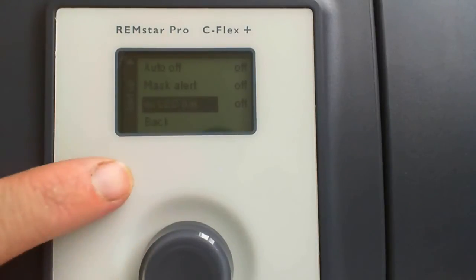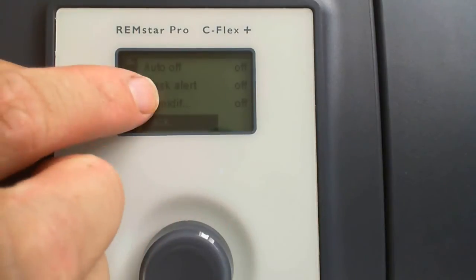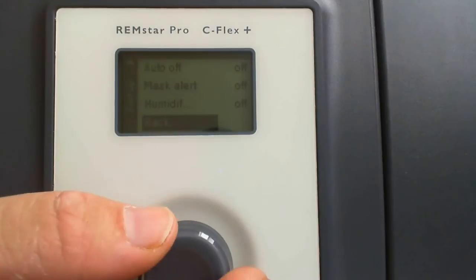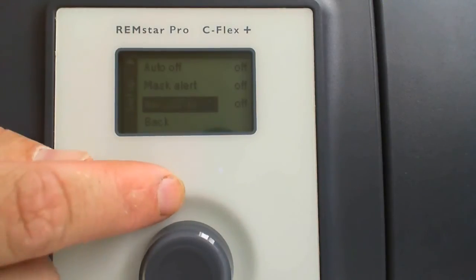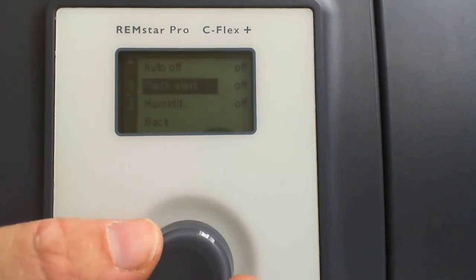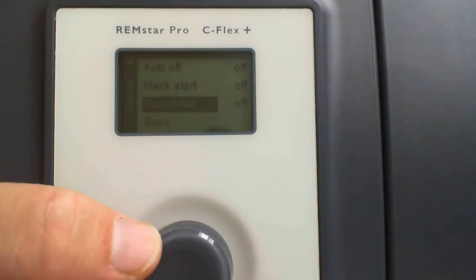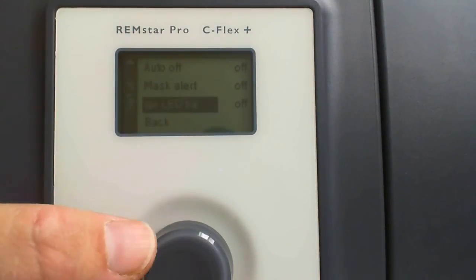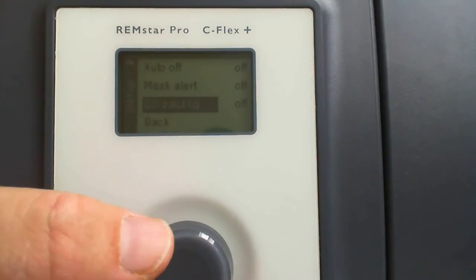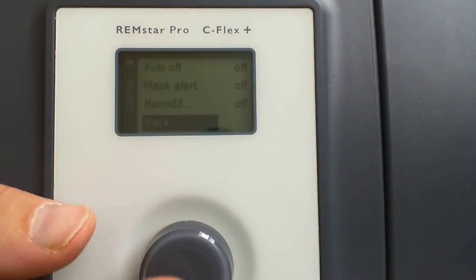So the humidifier, this is the humidifier LED backlight that I was talking about. Notice I've turned it off, and like I said, when you first turn your machine on, the therapy mode is going to show that number. Even with this off, it displays it for 30 seconds, and then when you change the dial again, these lights will come back on for another 30 seconds. So if you're light sensitive, maybe you want to use it as a night light. Go ahead and turn it on, because it'll just stay on all night. If you want to use a night light, that's fine. But Pappy likes to shut that off.